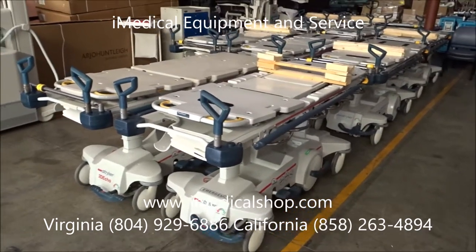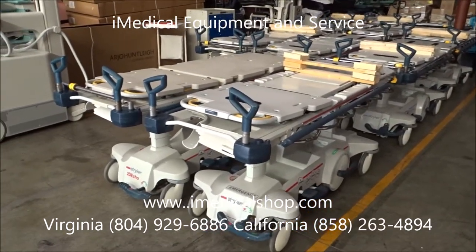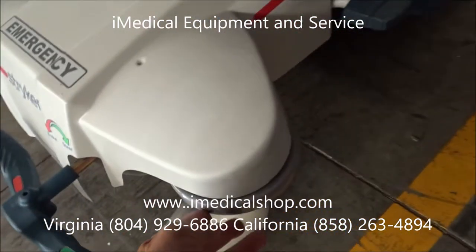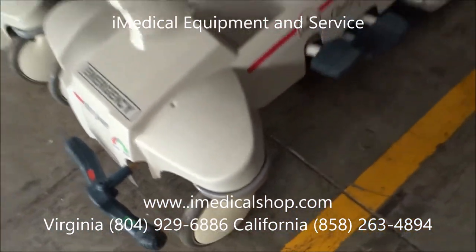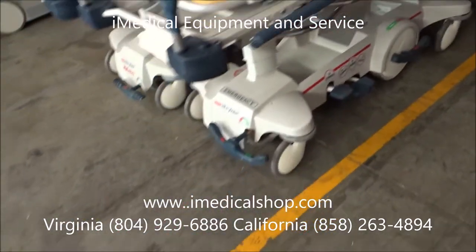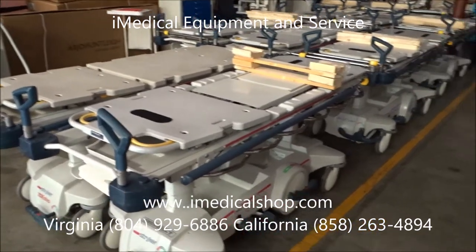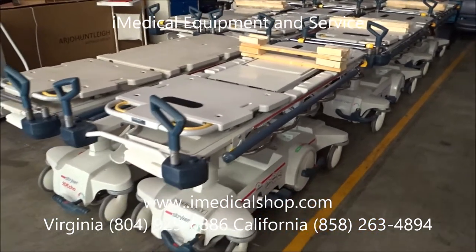You can see right now these are all the Stryker 1015s and 1005s that have gone through that process. They've all been re-dipped, they've got brand new rubber on them, the big wheels, and all those parts. The covers have all been taken off and repainted, and these are actually getting ready to go to a surgery center.